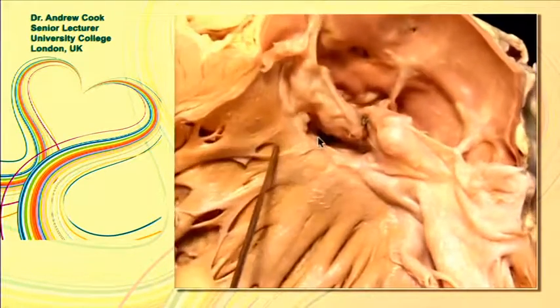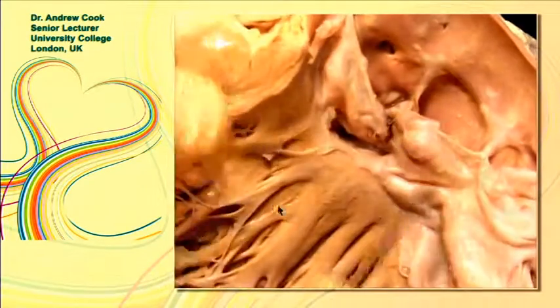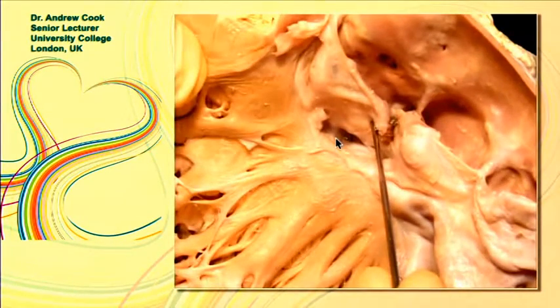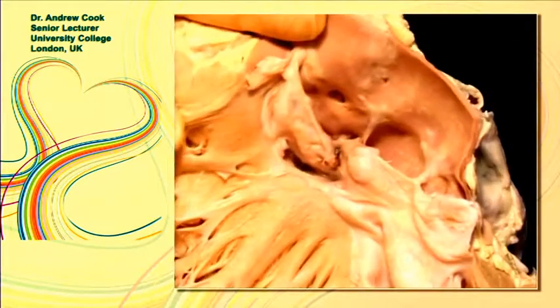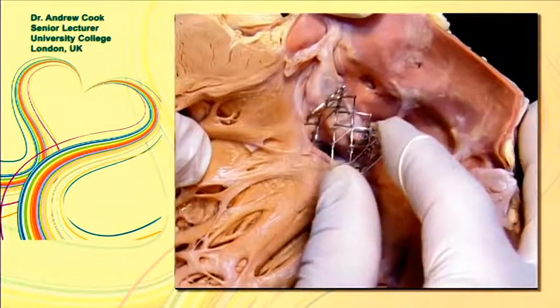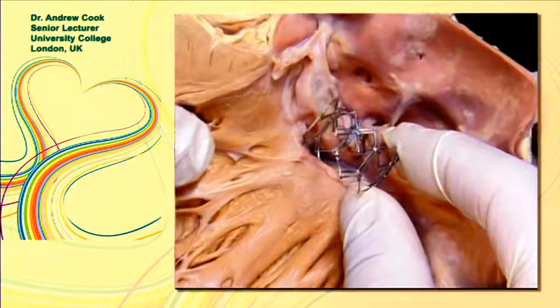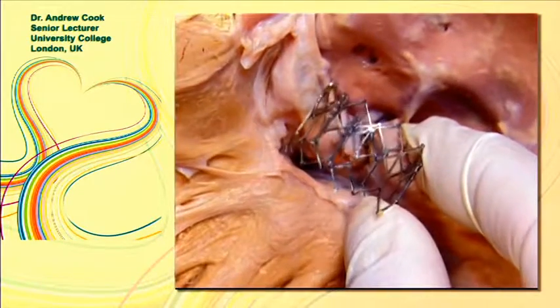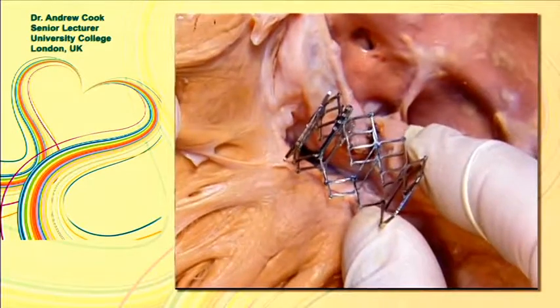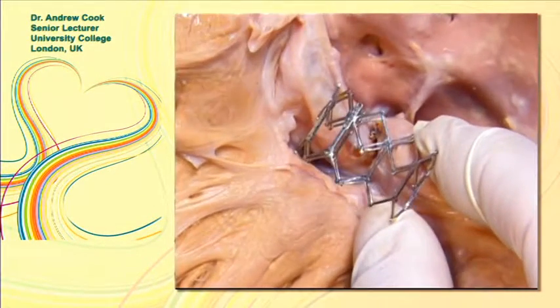It's really quite a deep recess, and that's a result of the septum bulging out over and beneath the right coronary leaflet. And the importance of that, which Bushra will emphasize at the end, is that it can displace a TAVI, a transcatheter valve. So you can see here that you need to be aware of the presence of the septal bulge and its relationship to the underside of the cage.